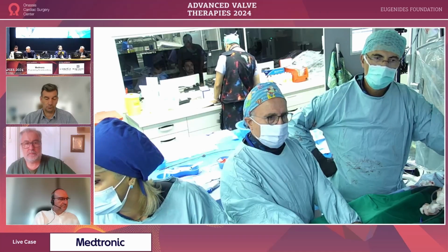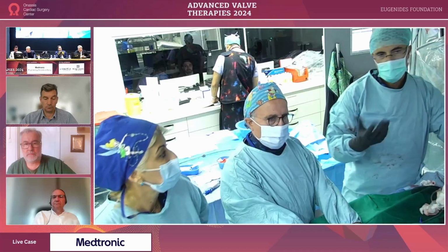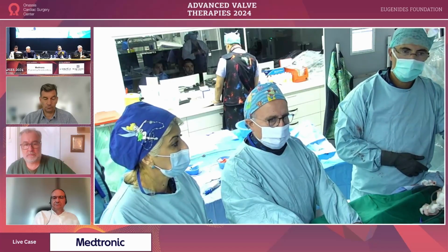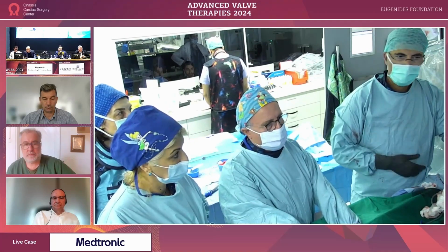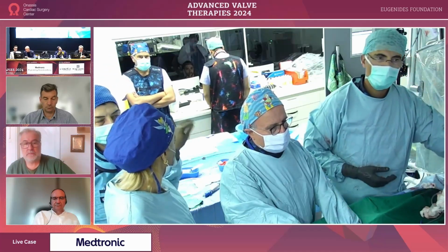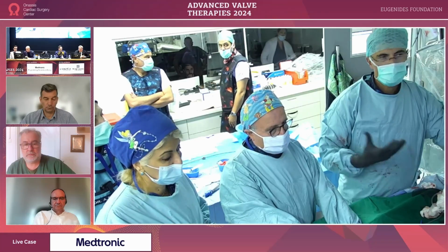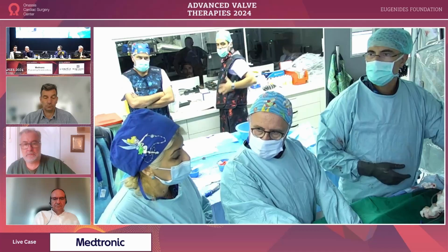But you need experience. Also, the patient has deep sedation, so maybe it's something that we can discuss as well. Maybe avoid deep sedation in certain patients. The patient is snoring. It's a lot of thoracic movement, as in this case. So, on top of that, we had an unstable wire and unstable thoracic movement. But it's definitely a teaching case.